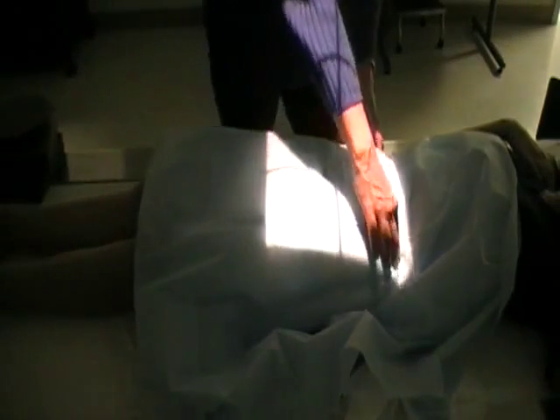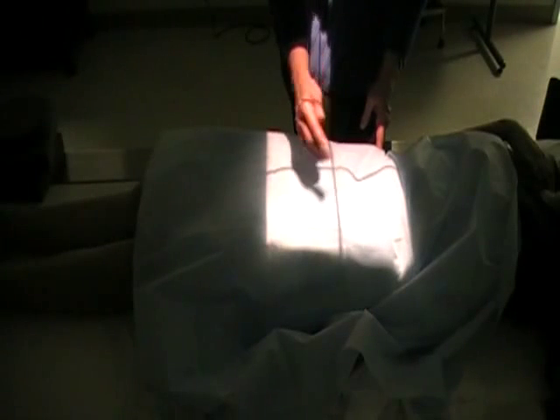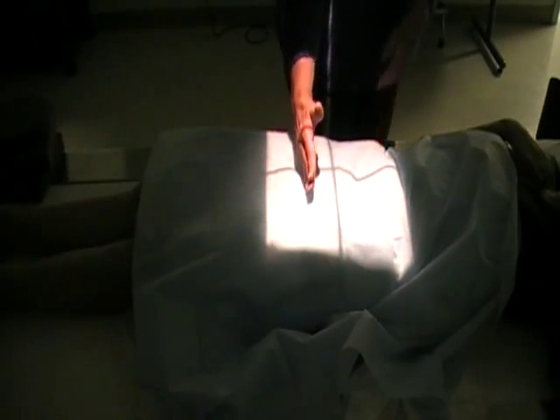Now I'm going to scoot the patient over just a little bit because we're a little too close to the edge of the table. Palpate the crest, and the top of our light is going to be approximately 1 inch above the crest. Okay, or our central ray is going to be 2 inches above the pubic symphysis.